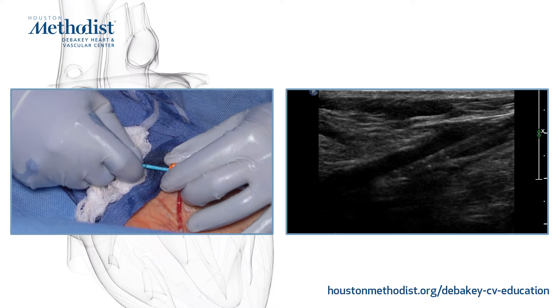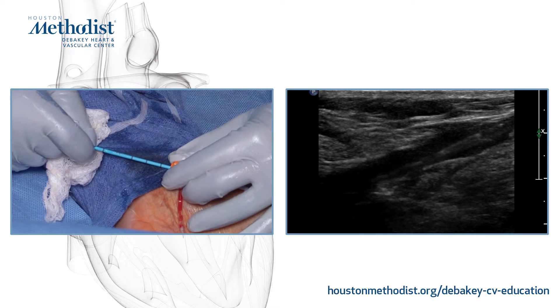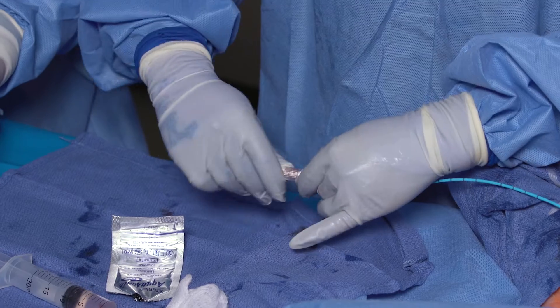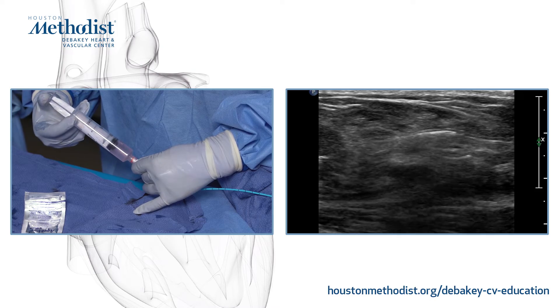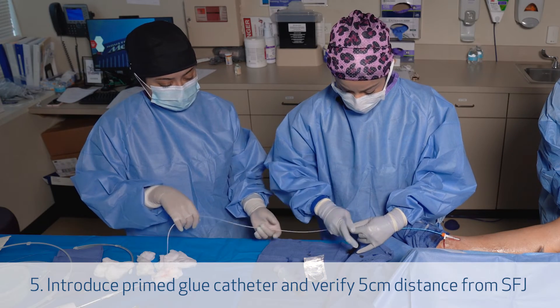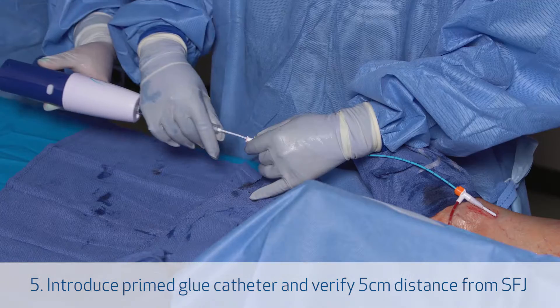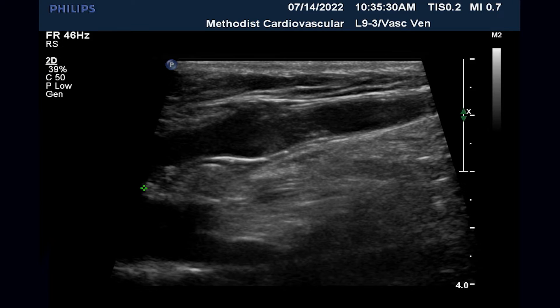We visualize the blue catheter once again at the saphenofemoral junction, and at that point we pull it back 10 centimeters. We then remove the dilator and do a forward flush with saline. Now we're introducing the glue catheter, which we primed before. This screws into the blue catheter, and now the tip of the glue catheter should be 5 centimeters from the saphenofemoral junction. With VenaSeal, you want to be 5 centimeters away, unlike the thermal techniques where you want to be 2 to 3 centimeters away.